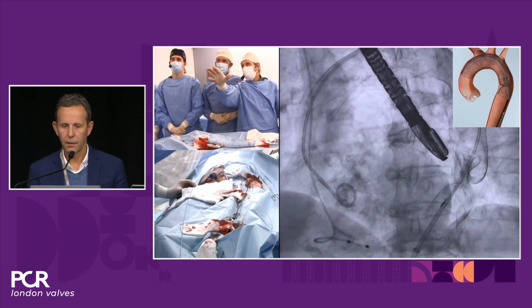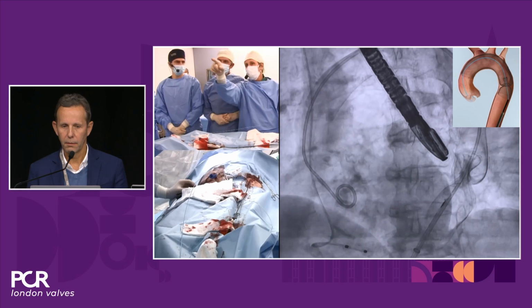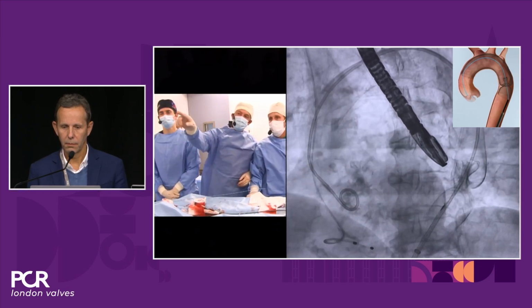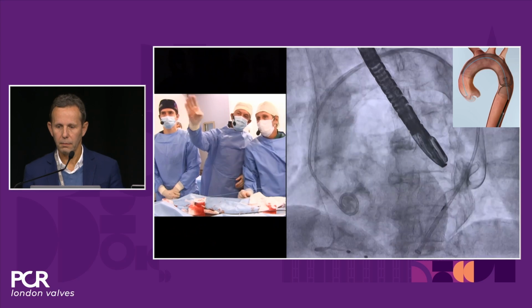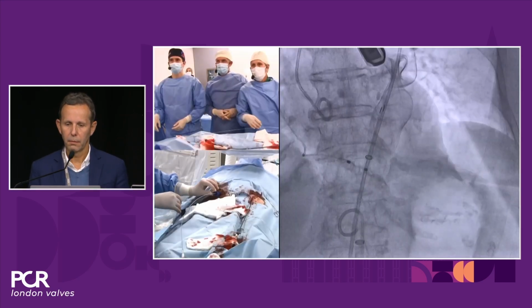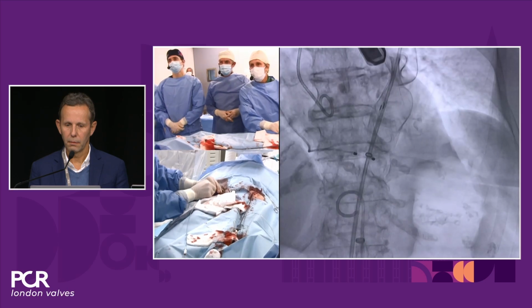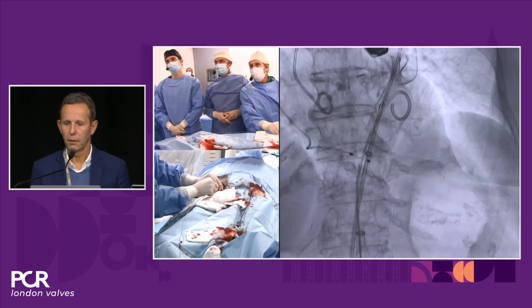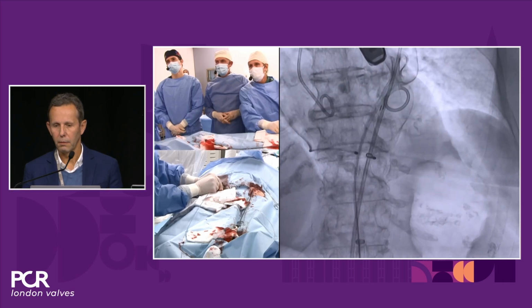And the pigtail inside it is well positioned in the non-coronary cusp. You can clearly see that the pigtail is inside the port, right? And in the position that is going to help us to position the valve. Now we advance the pigtail, and the idea is to, of course, do it inside the Emboliner and not at the side of the device.